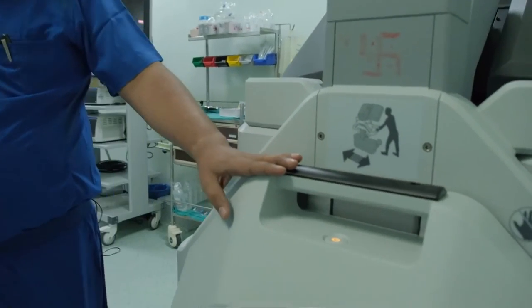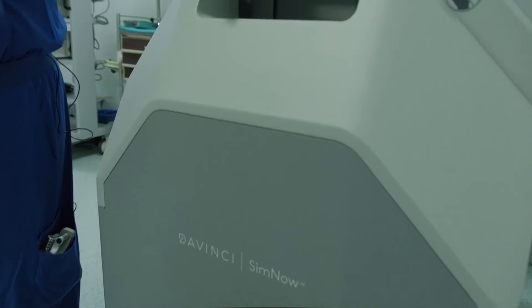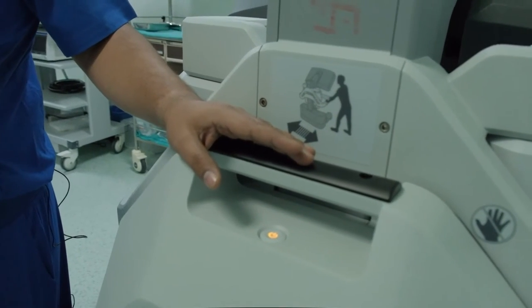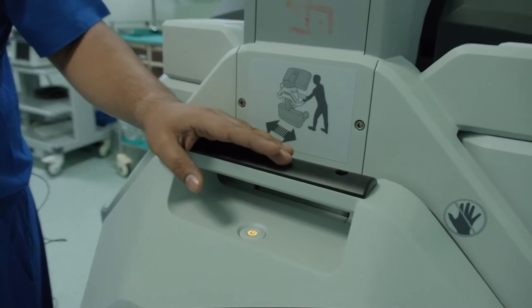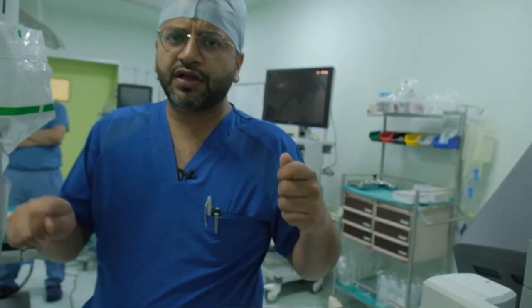With the Da Vinci Xi system, we have a simulator at the surgical console, and this is an advanced simulator to allow the residents, the trainees and the surgeons to upgrade their skill set for robotic surgery. They can use this simulator for training themselves and allow themselves to get into a better shape as far as using the surgeon console and the robotic surgical instruments is concerned.